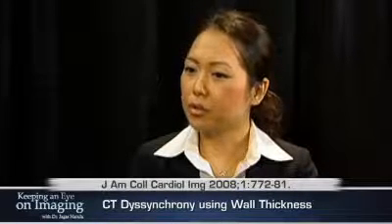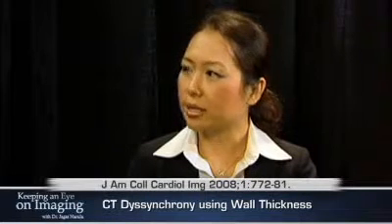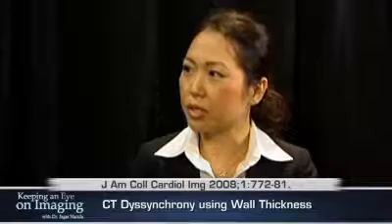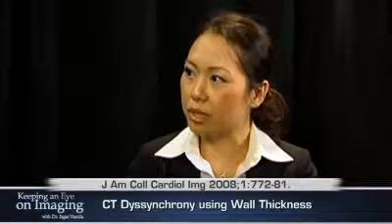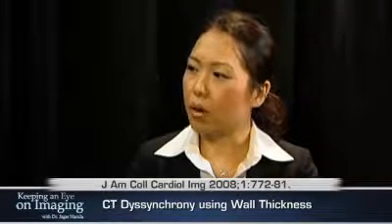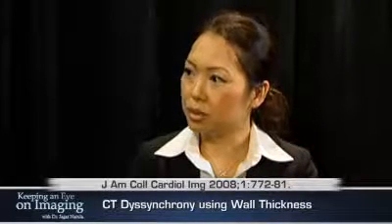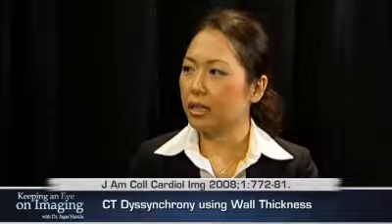So from the short axis images of the left ventricle, we measured several CT-based global and segmental parameters. We looked at time to maximum wall thickness, time to maximum wall motion, and time to minimum systolic volume. What we found was that the wall thickness measure that was global had the best reproducibility, and we called this DI for dyssynchrony index.